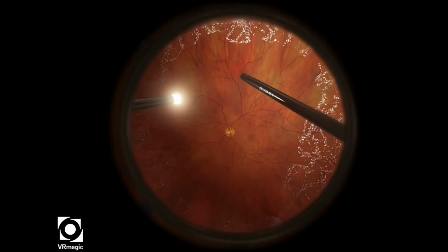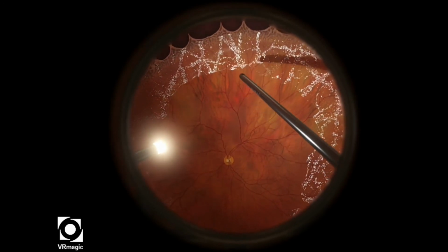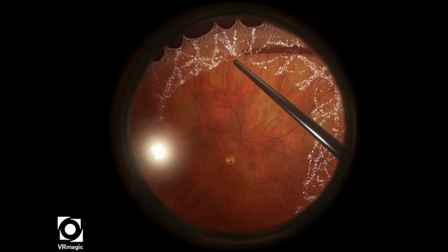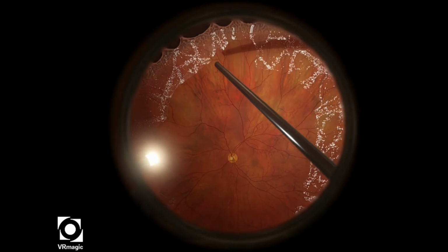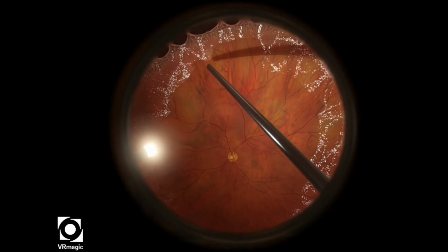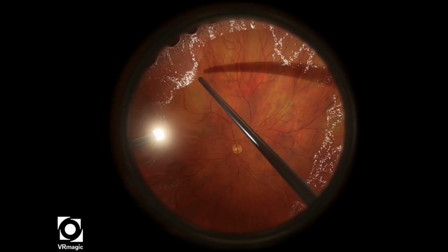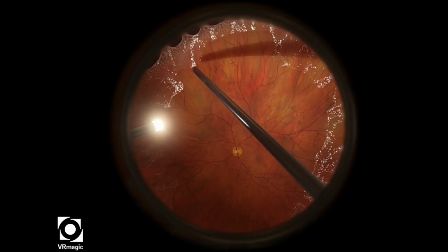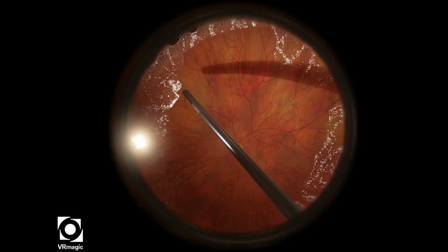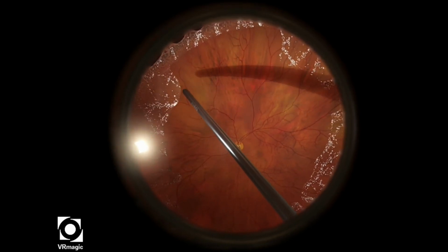And then when I get to a certain point, I decide that I want to aspirate a bit more of that peripheral vitreous and then cut as much as I can. In this case, you notice that the edges of the area where I was starting to cut started to come in because of the aspiration level. So again, you could induce tears if you're not careful. So lift, dissect easily, and then cut. So lift here, and then I'm dissecting very gently, and then I'm cutting the rest of the vitreous away.